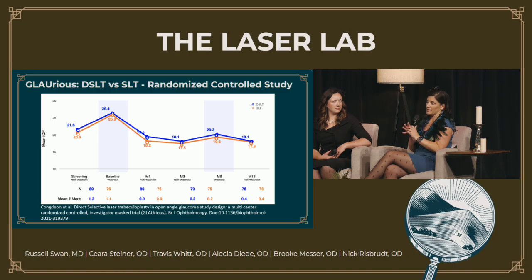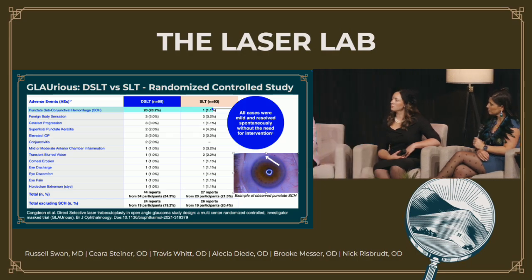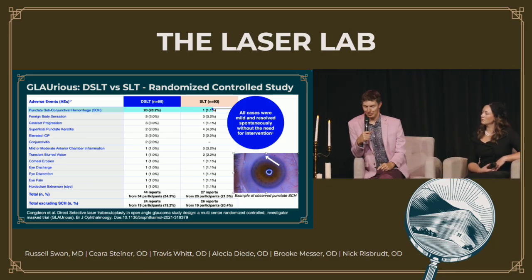The patient comments on a warming sensation, not necessarily burning, so I usually just let them know that they'll feel a warming sensation for 2 or 3 seconds, and that's it. So it's very, very fast. I would say it's far better than having to use a gonio lens to do indirect. So very good patient experience. And a really nice procedural experience from a provider standpoint, having not done it.